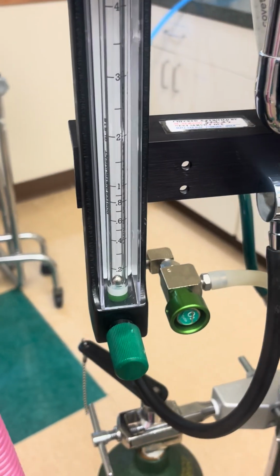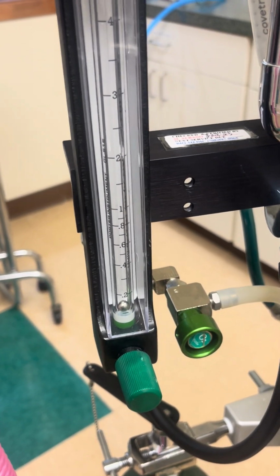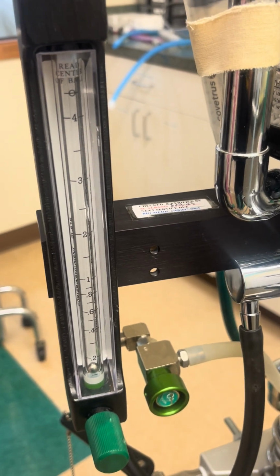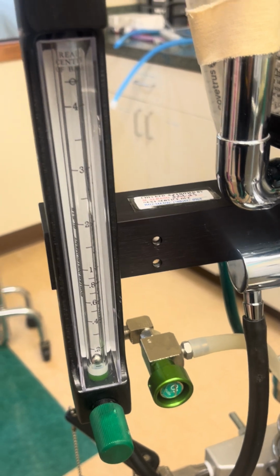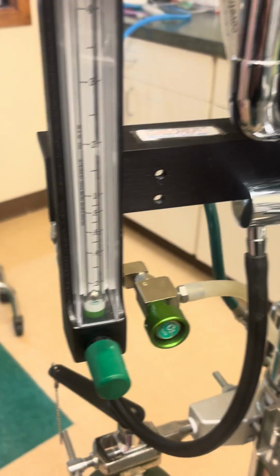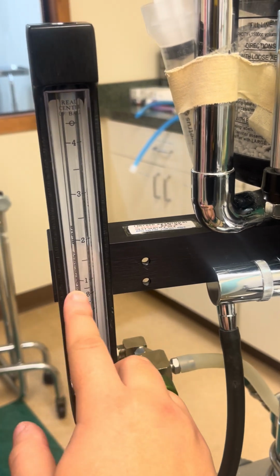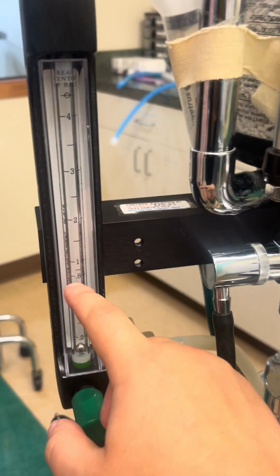Next is our flow meter. This is the sixth step, and it allows you to monitor and control how much oxygen your patient is getting. It will show you the O2 in liters per minute, and it reduces pressure from the gas to a safe pressure for the patient. It's about 15 to 20 psi. The ball in the center of this part right here, when you turn on the oxygen, you want to set it to a certain liter. You just turn this on and the ball will rise.